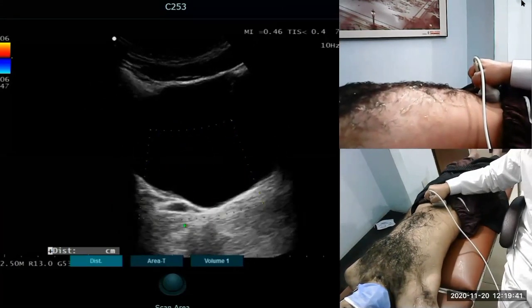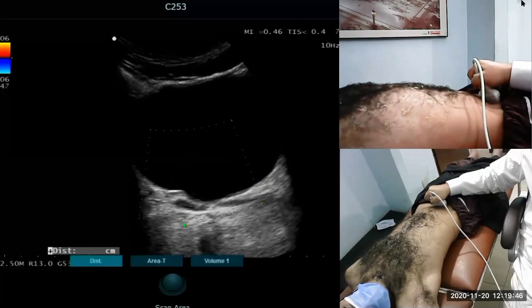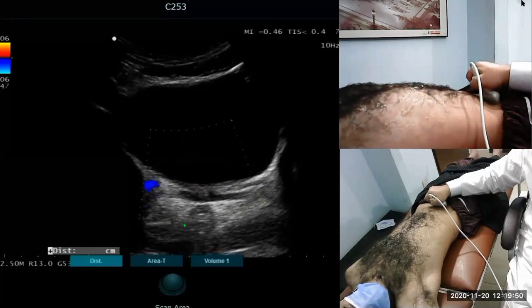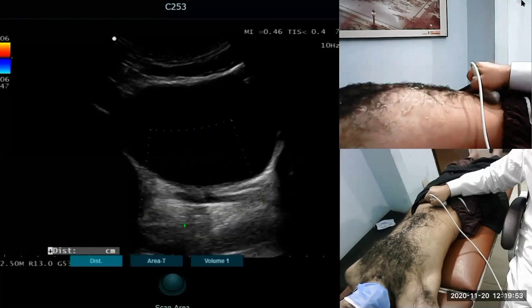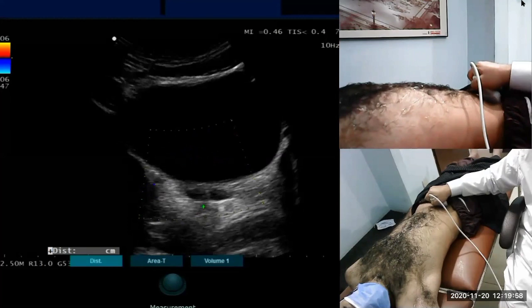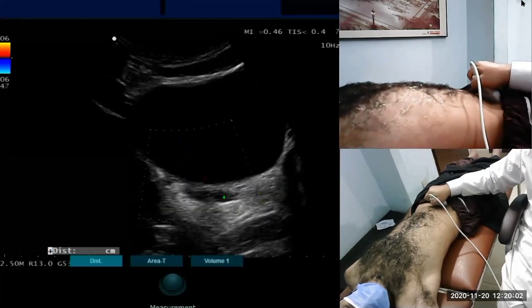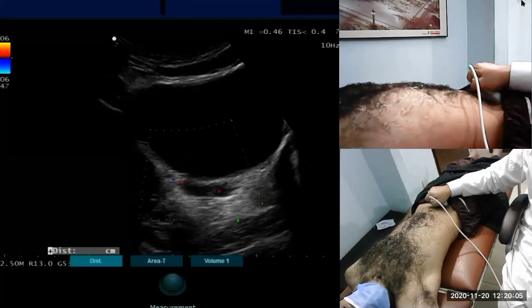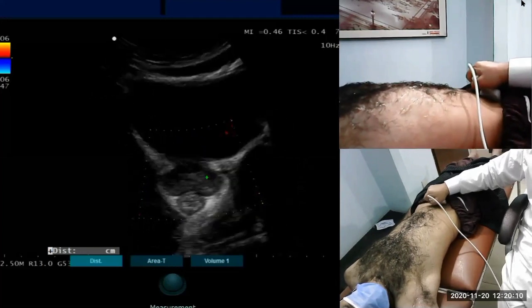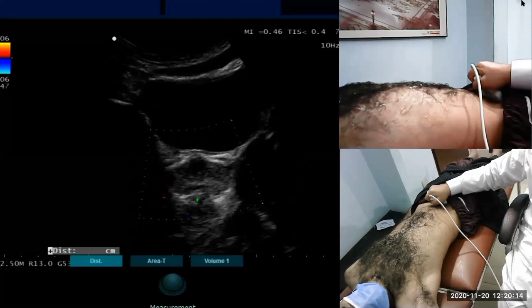So within 1.5 minutes, you will see a urinary jet coming out. In the meantime, we can see the seminal vesicle, the right and the left. Seminal vesicle behind the bladder going into the prostate. This is the prostate and the anal canal behind. This is it.